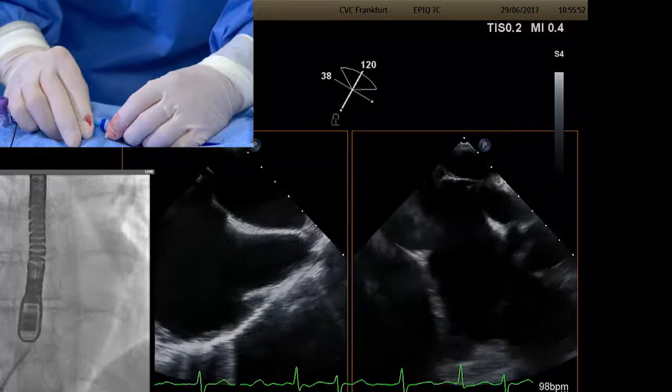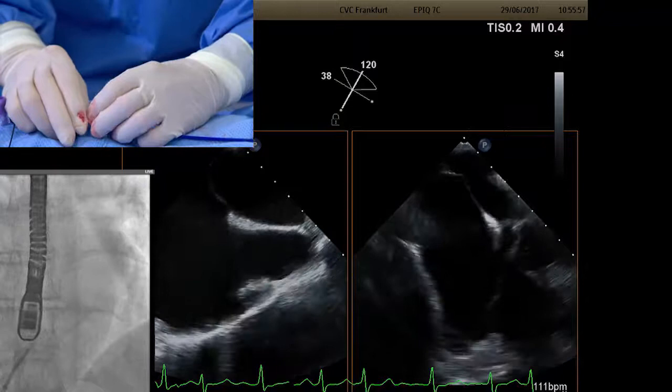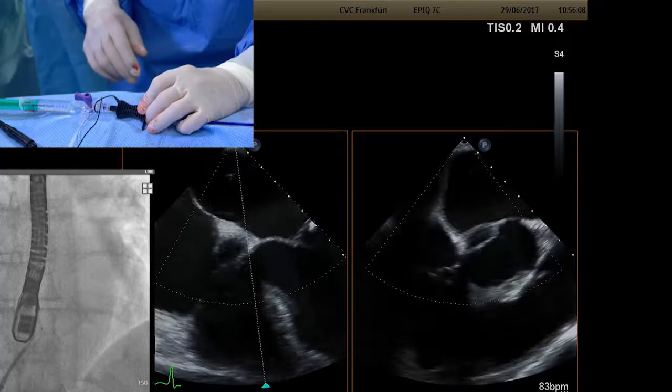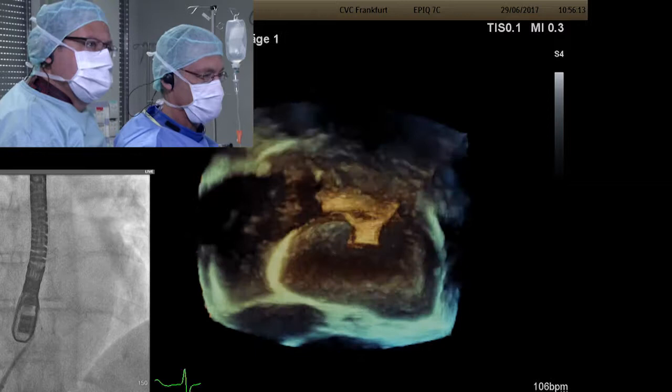The needle should be through. There's still a little bit of tenting, so advancing a little more. The pop is felt — it should be through. Injecting a little contrast to confirm. We are across. The Baylis RF system has a blunt tip, so when across, it's not likely to puncture the opposite side.